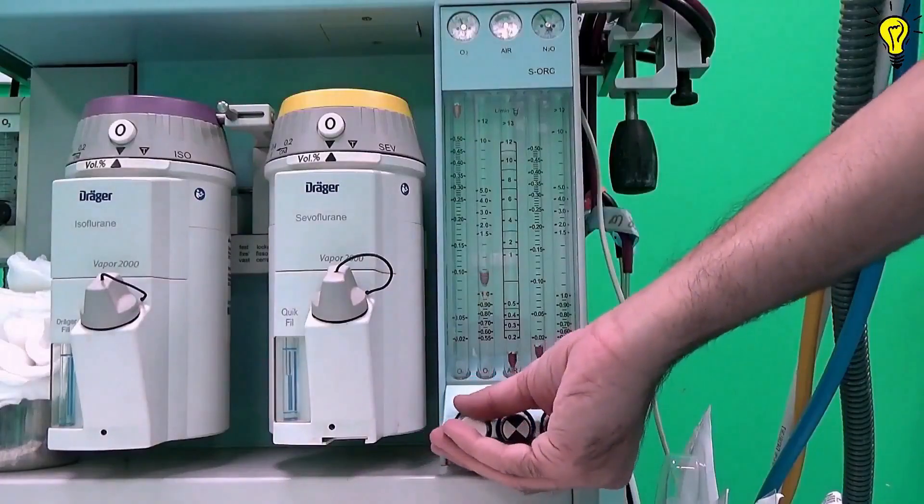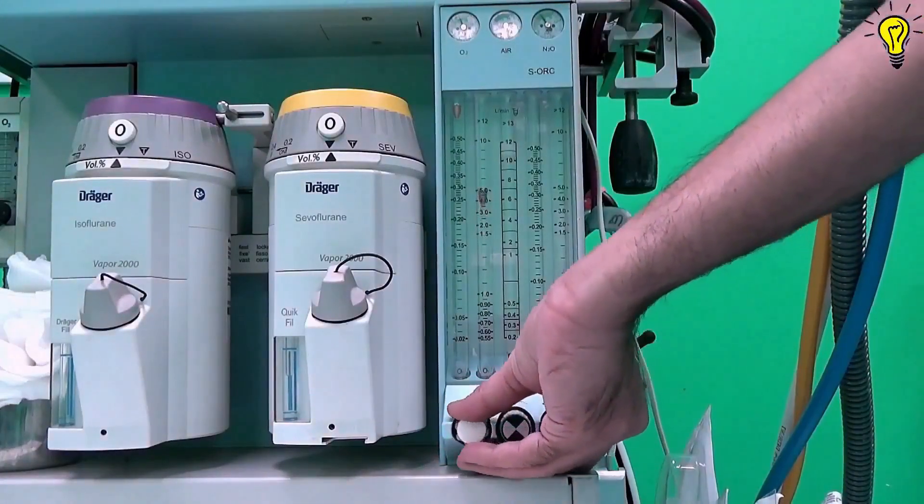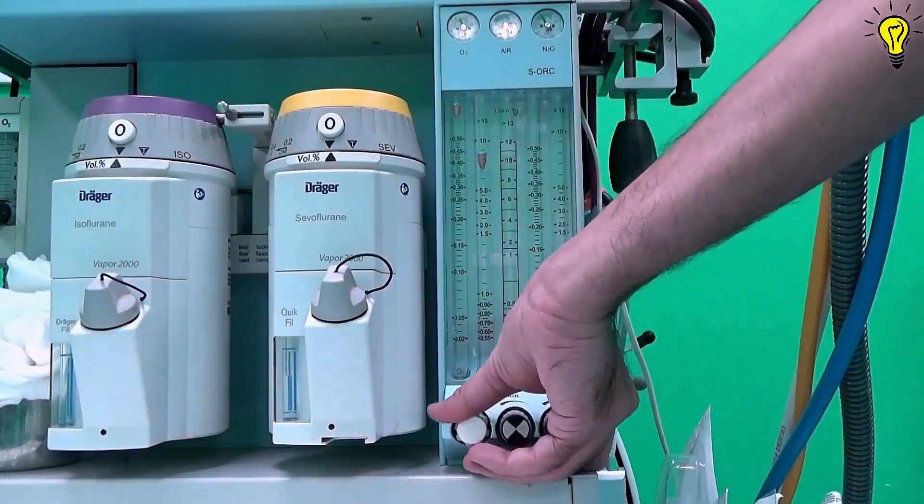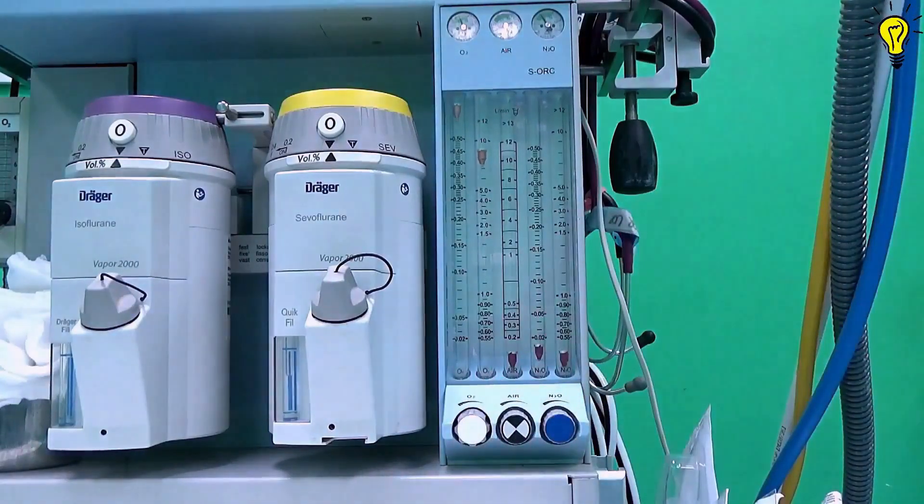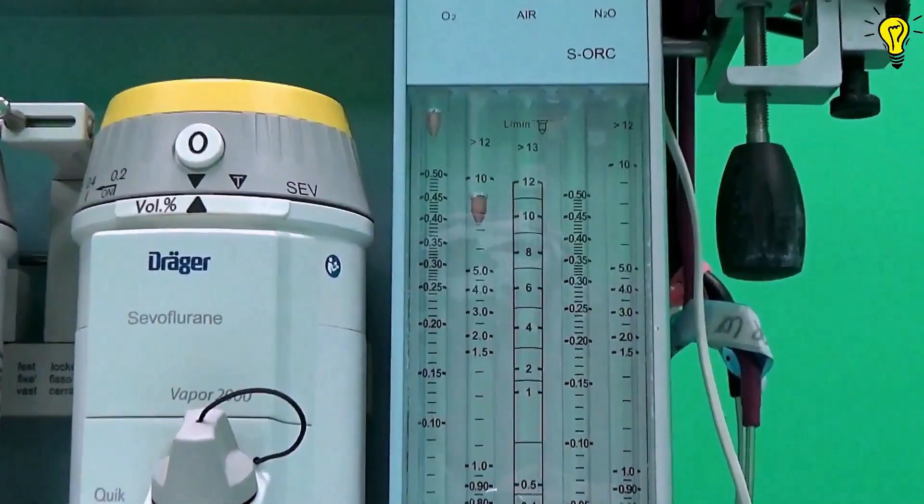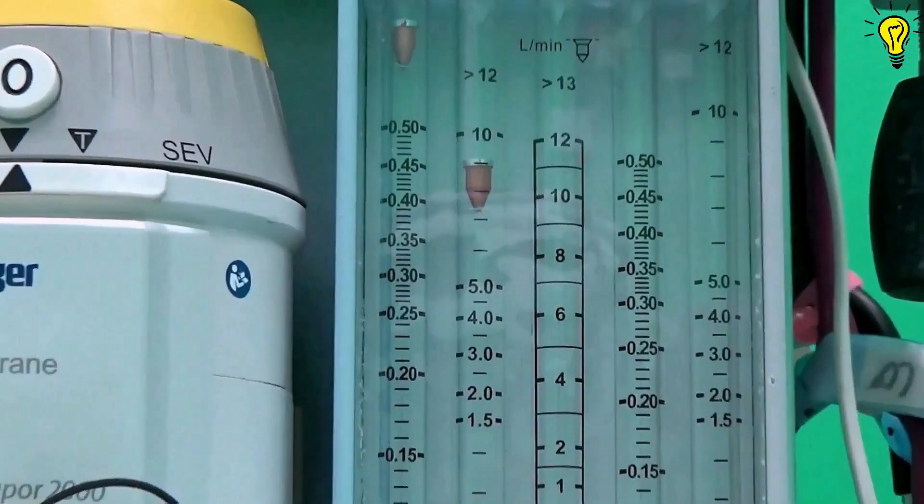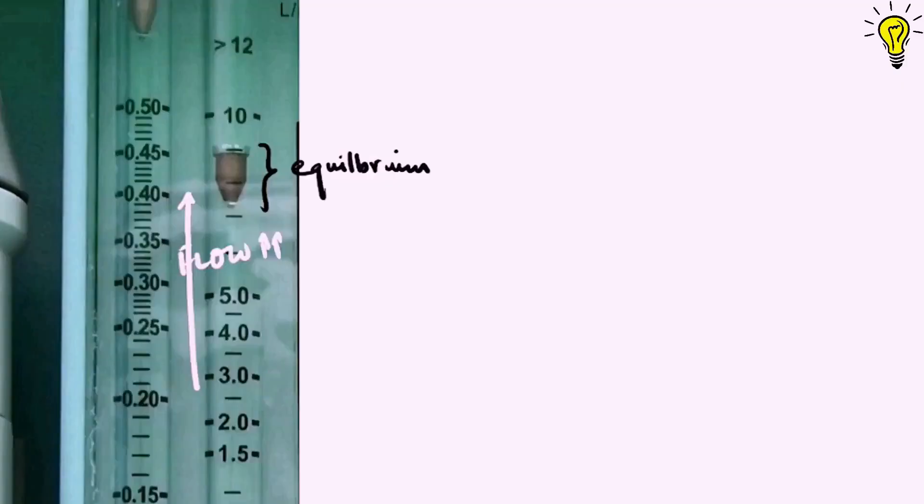Now if I increase the flow of oxygen, the float will move upwards assuming a new position. But it will again maintain its equilibrium where the two forces balance each other out. So you see the pressure drop against the float or across the float has remained constant. Only the position of float has now changed in the tube depending upon the force exerted by set flow rate against gravity. Hence it is called constant pressure.